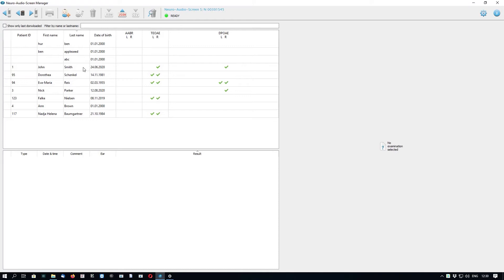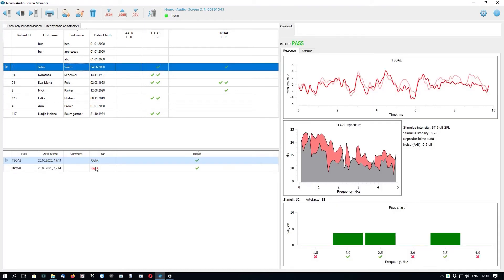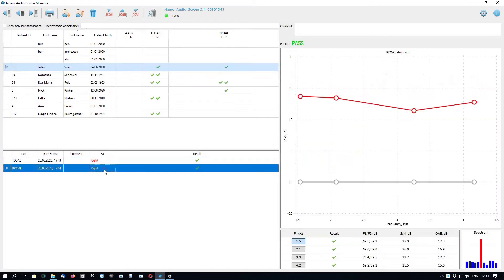For example, let's look at this patient and his results. Here we can see the downloaded test results.